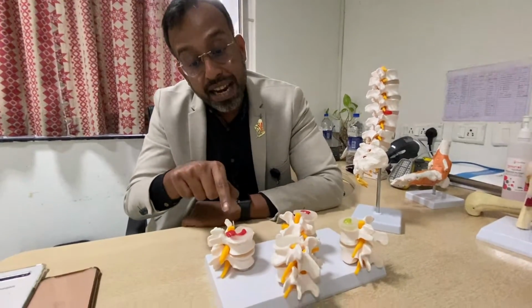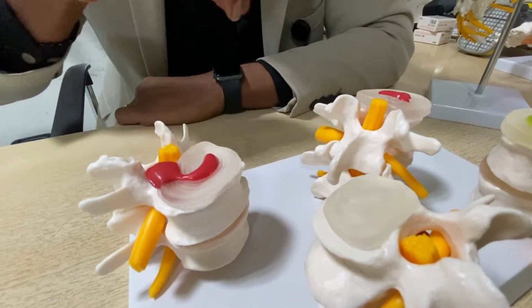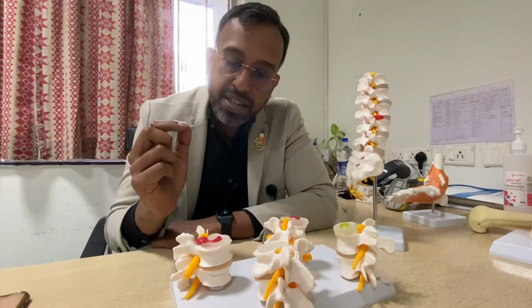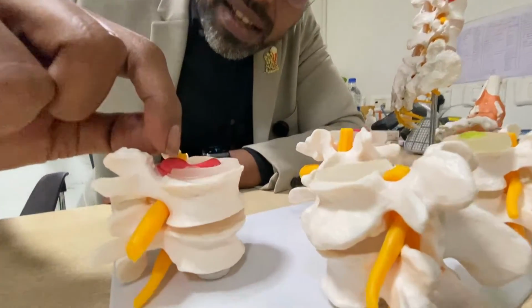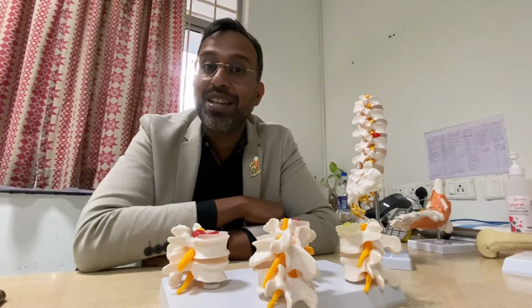But moving to the next one, if you watch here, the disc material is entirely on the outside, and that could cause a compression in the spinal cord, which causes the pain. And now in the procedure, I will be injecting and entering into this region, and I will be extracting out this disc material and also repairing it. And that is the procedure you will be seeing today.